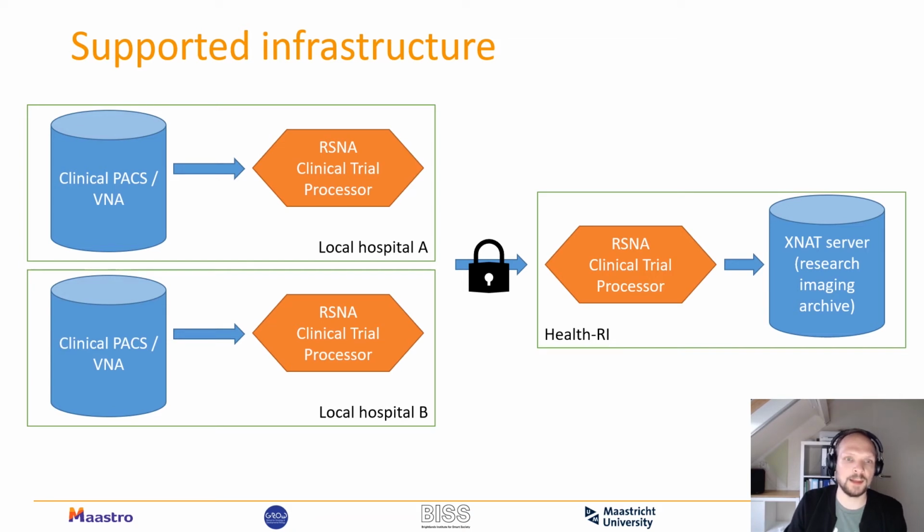This is then implemented for all hospitals participating in a specific research project, in a multi-center research project, where the researcher will get access to the central XNAT server where he or she can pull the data from, or maybe put a compute node next to this XNAT server at their own expense to perform calculations on these central images.